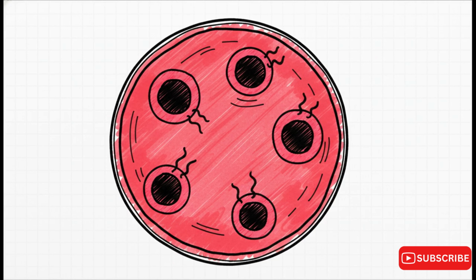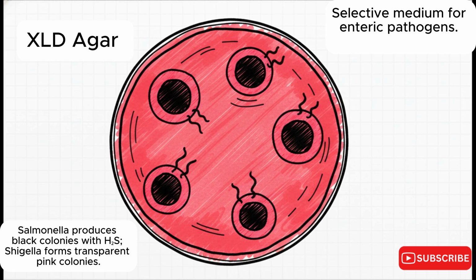Building right on that, we have XLD agar, which stands for xylose lysine deoxycholate. This agar starts off as a bright pink or red plate. It's a really elegant tool, specifically designed to isolate Salmonella and Shigella. And it relies on a fascinating chemical reaction. Salmonella produces hydrogen sulfide gas. The agar reacts to that gas and literally paints the center of the Salmonella colonies solid black, making them instantly identifiable against that bright pink background.